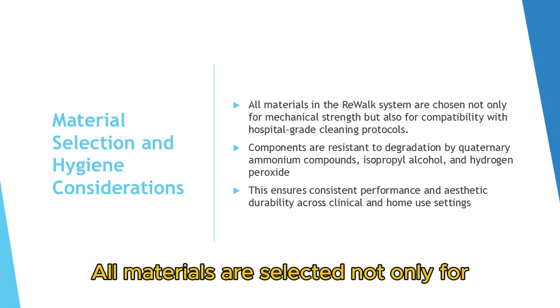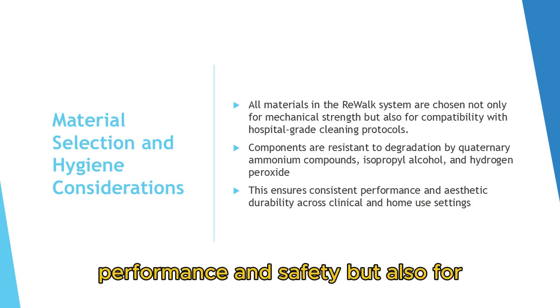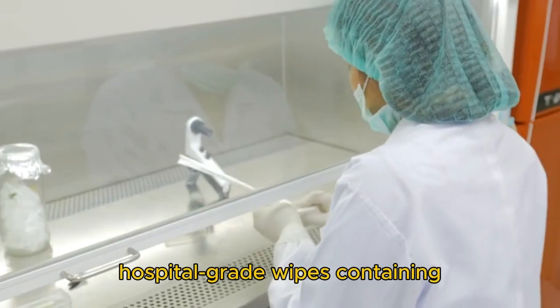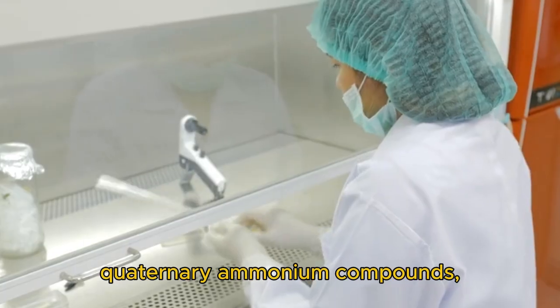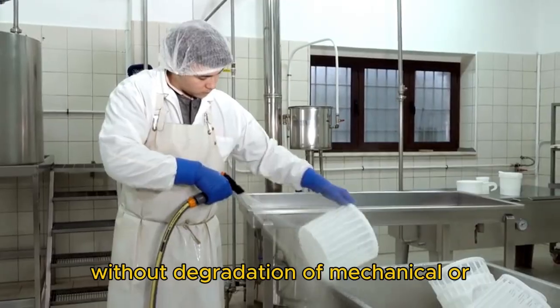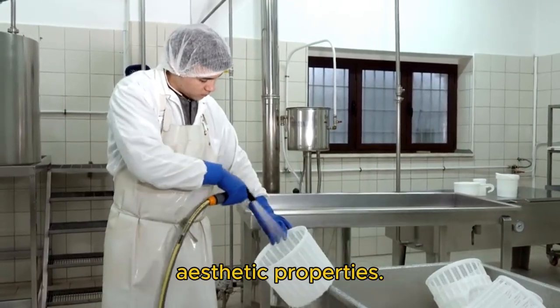All materials are selected not only for performance and safety, but also for ease of disinfection, using standard hospital-grade wipes containing quaternary ammonium compounds, isopropyl alcohol, or diluted hydrogen peroxide, without degradation of mechanical or aesthetic properties.